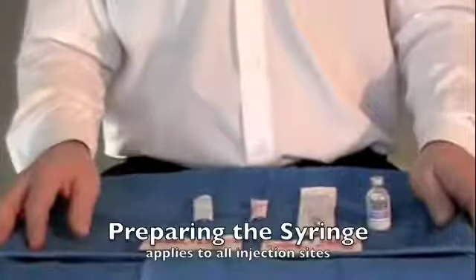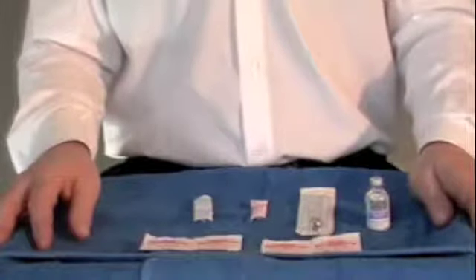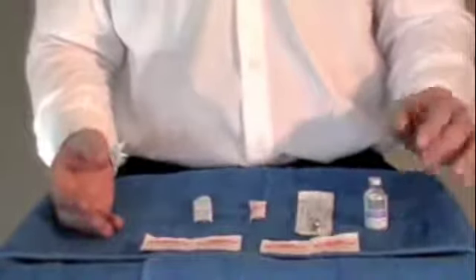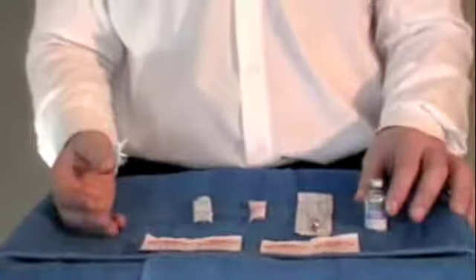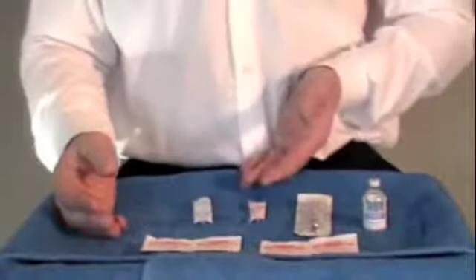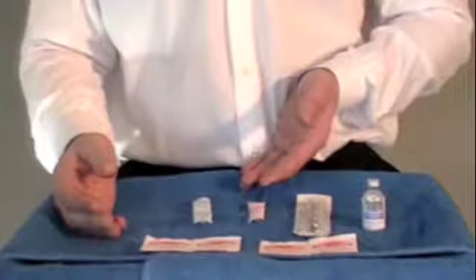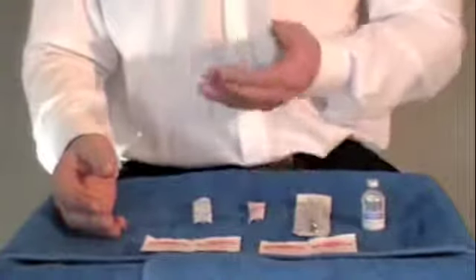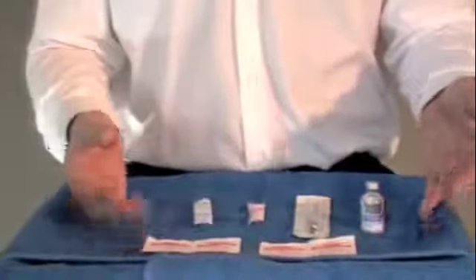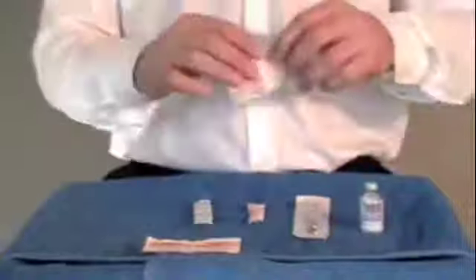At this point, I would like to instruct you on how to prepare the syringes for injection. Again, you'll want to assemble all the products that you will need. In this case, a vial of testosterone cypionate, your 1 cc lock syringe, 18 gauge needle for drawing up your testosterone, 25 gauge needle for injecting your testosterone, multiple alcohol swabs to cleanse the vial and the injection site.